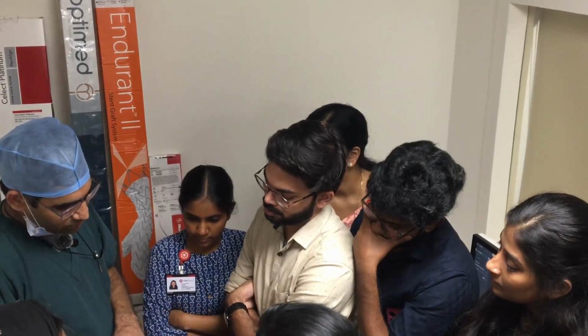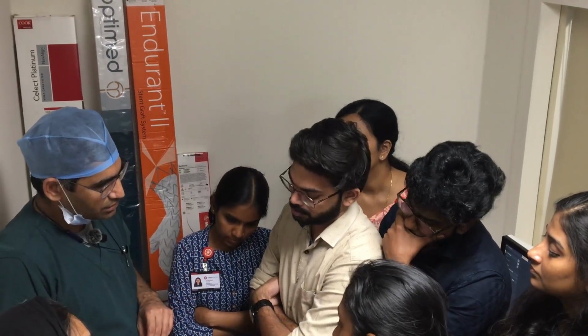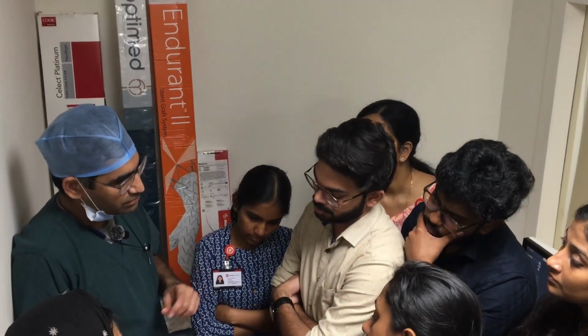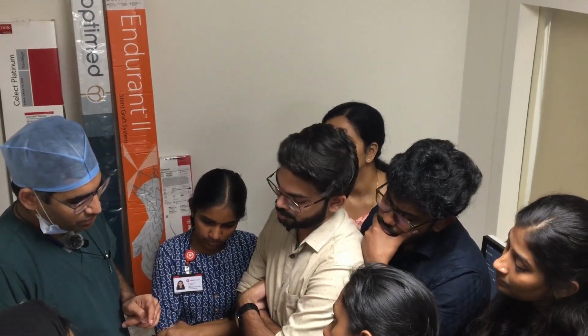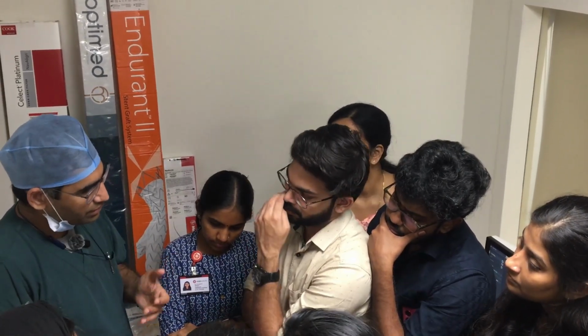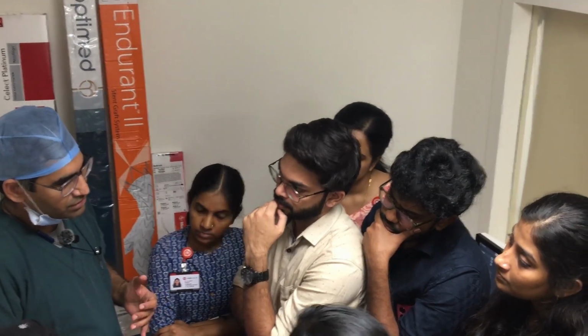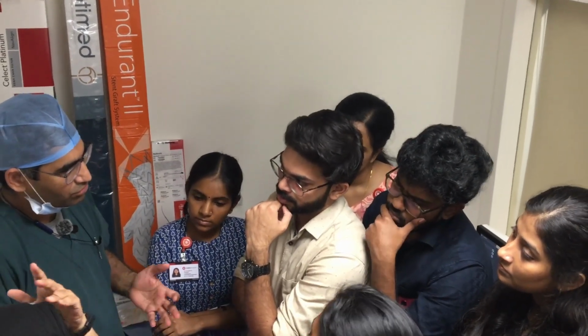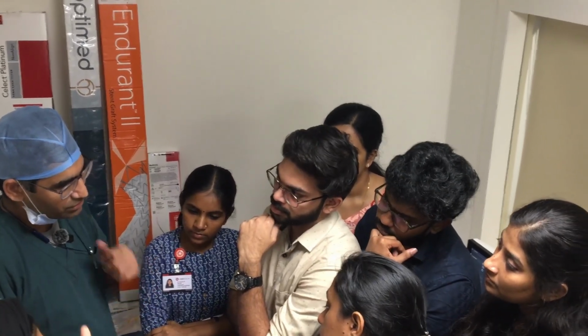Then the length of the balloon. The length of the balloon should always be longer than the lesion. If you are treating a 3 centimeter lesion, use a 4 centimeter balloon. It is better to cover the entire lesion with one balloon. If you have a 10 centimeter lesion, you cannot do it with a 4 centimeter balloon. You can do that, but the best result is with one balloon if you have it.